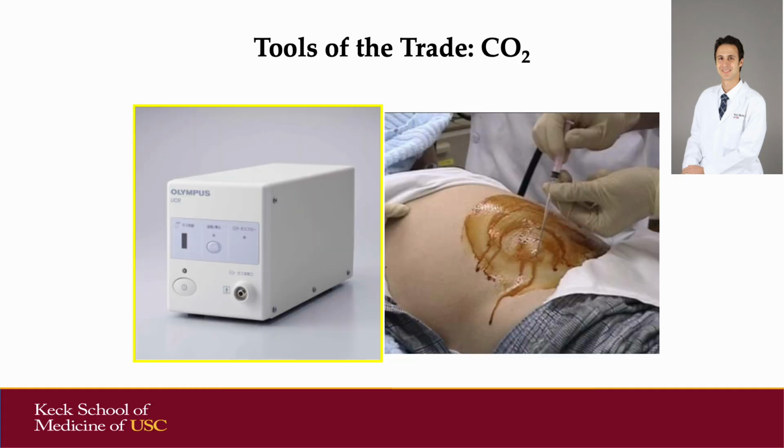The use of CO2 insufflation is also essential for performing ESD. These can be very long procedures, and CO2 allows for patient comfort during the procedure. There is also a risk of perforation when performing ESD. If a small perforation occurs and CO2 is being used, the dissection can be continued and the perforation can be repaired with clips, allowing for continued dissection. However, there is a concern that if air insufflation is used and there's a small perforation, that could quickly result in a significant pneumoperitoneum.